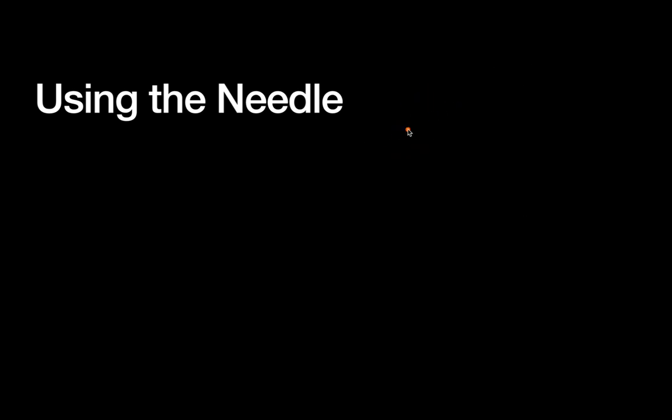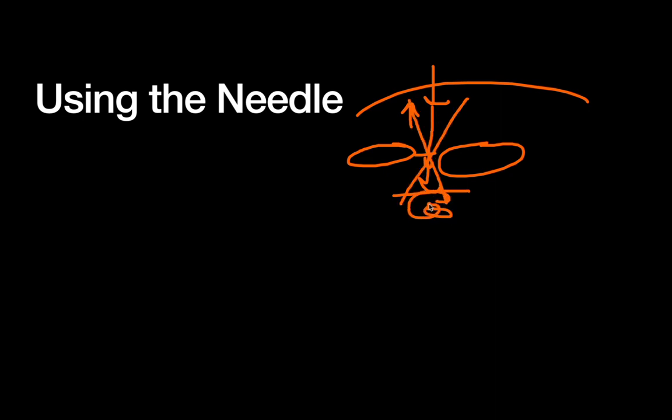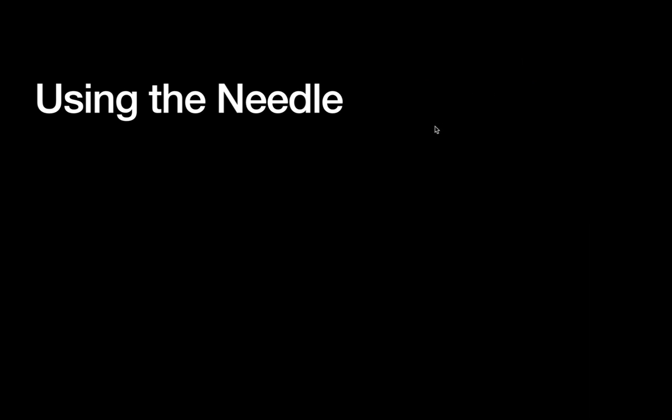So again, a quick review of all the different aspects and techniques that we use to access the abdominal cavity safely. Let's do it this time in the midline at the umbilicus. We go through the skin. Then we come down here. We get one click at the linea alba. We get a second click through the peritoneum. And remember, we've been holding up on the umbilical stock this whole time, trying to pull the wall away from our intra-abdominal contents. We hear our two clicks. We wiggle our needle along the axis. We feel like the tip moves freely. Then we do our aspiration tests. We don't aspirate any blood or bile. We feel good about that. We inject some saline that flows freely. We feel good about that. We take the syringe off. Watch the liquid fall down into the abdominal cavity. We feel good about that. And then finally, we hook ourselves up to our insufflation. Look for our initial pressures. We see a single-digit pressure, let's say six millimeters of mercury, and then we are pretty confident that we're in, and then we can start insufflating the abdomen, usually using high flow at that point.